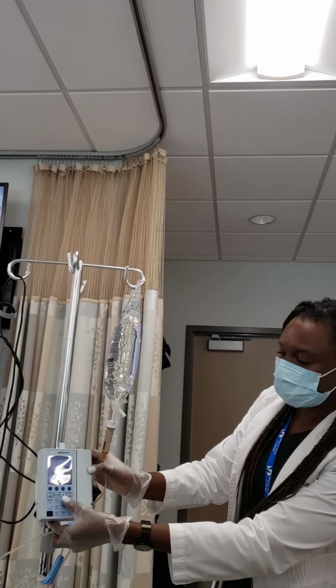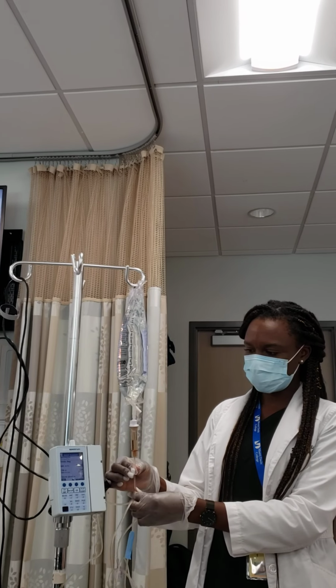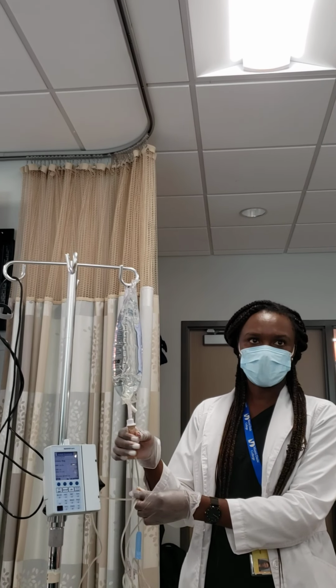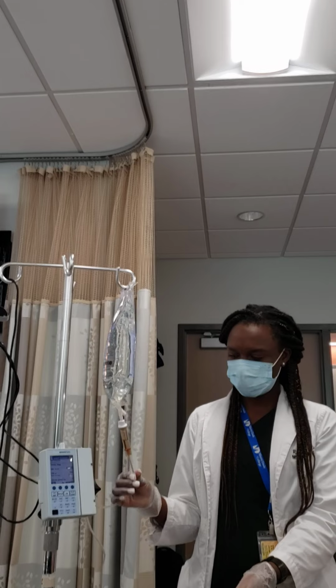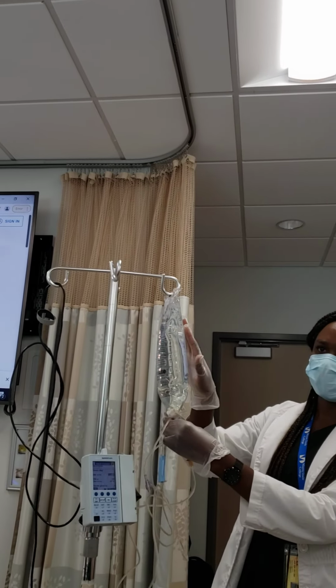You can. Most people, what they do, you can put it anywhere that you want to. Most people put it up here, but never put it here because why? How are you going to see what's dripping? Yeah, you can put it here, below, and then you also label the bag.